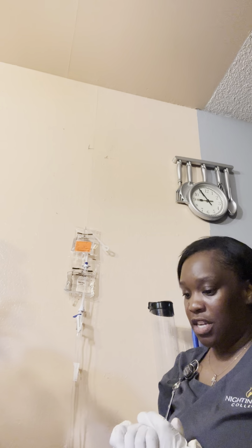All right, so now that it's all done, you're going to go back and recheck the patient's site, make sure it's not irritated, they're not in pain, any redness or swelling again. You're going to make sure your patient is comfortable. You're going to give them a call light, see if they have any questions. You're going to wait around for a little while just to make sure that there's no sensitivity or reactions to the amoxicillin.